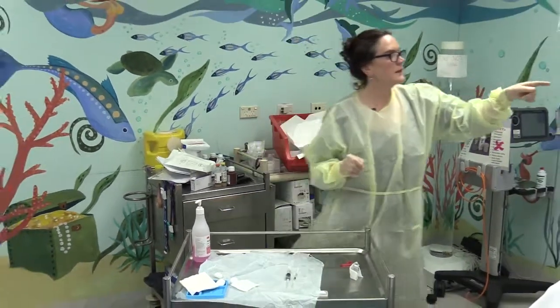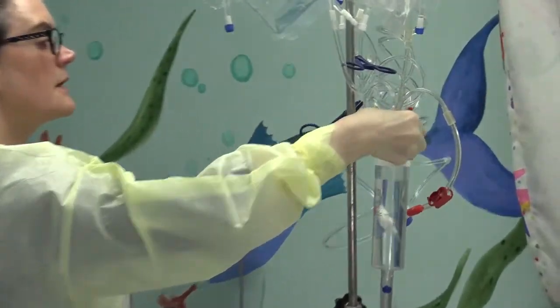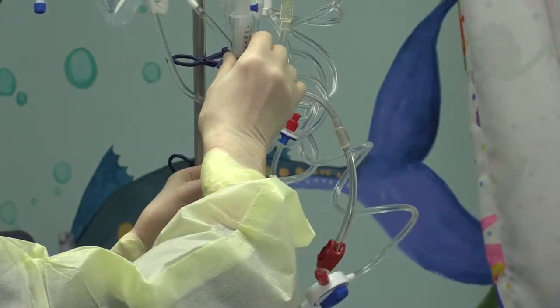I'm going to add the medication to the injection port here. So I'll just wipe that, make sure that it's absolutely clean, and being very, very careful not to contaminate or to touch any of the non-sterile equipment.